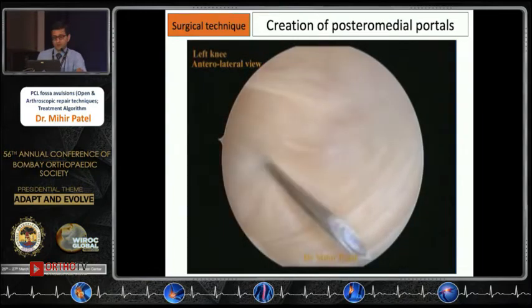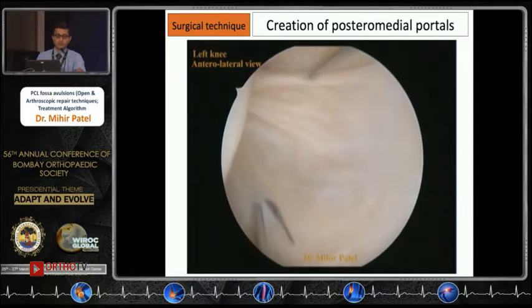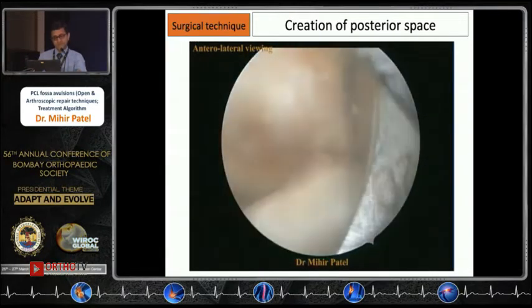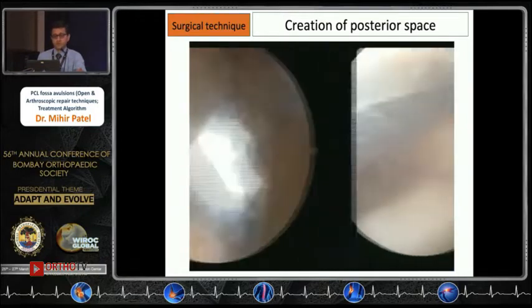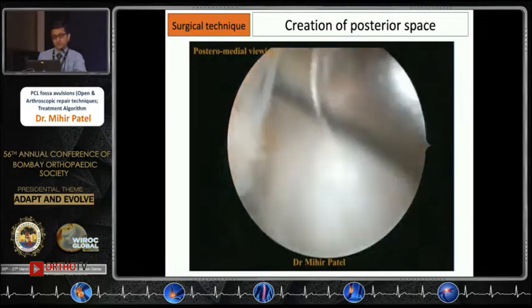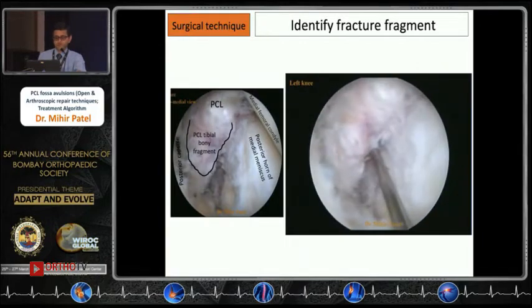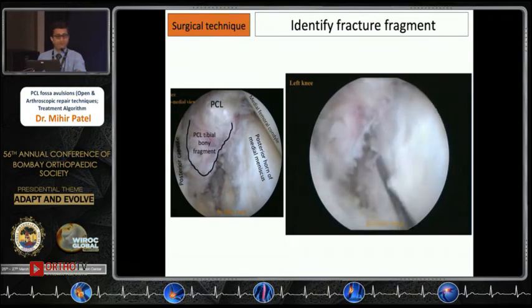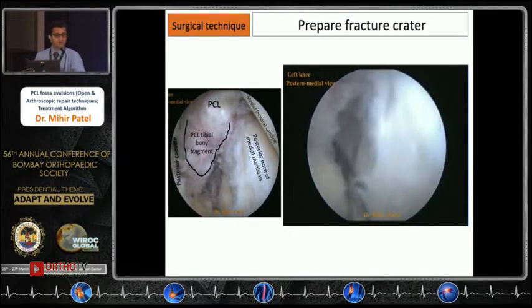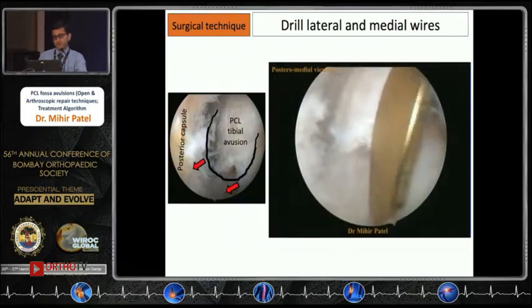Two windows are dissected on either side of the PCL — the medial and lateral PCL windows — used to work behind the knee. We advance into the posteromedial compartment through the medial PCL window and create two posterior portals using the out-to-in technique. The inferior posteromedial portal houses a 5.5 mm cannula for suture management; the scope is stationed in the high posteromedial portal for a bird's-eye view. A PCL elevator passed through the lateral PCL window separates the posterior capsule from the fracture fragment. An arthroscopic shaver removes the synovium, and the fracture fragment and crater are clearly identified in magnification.